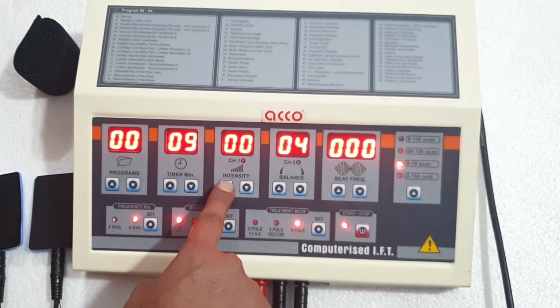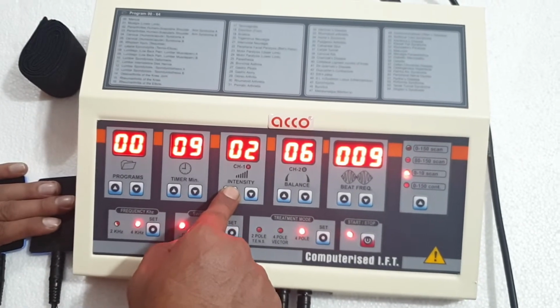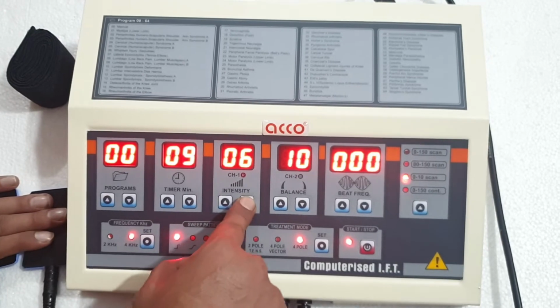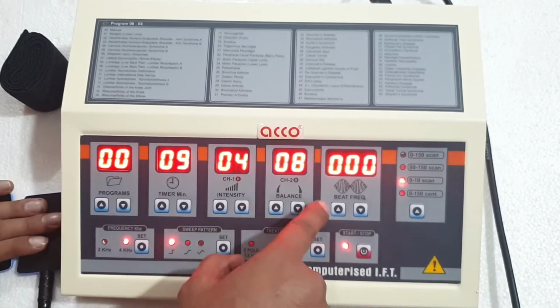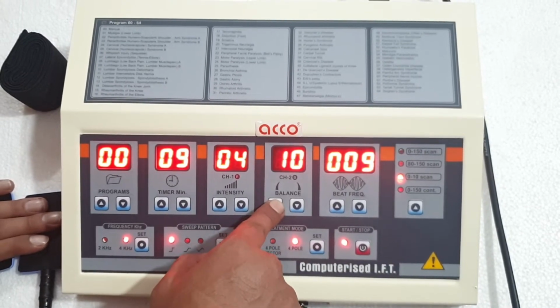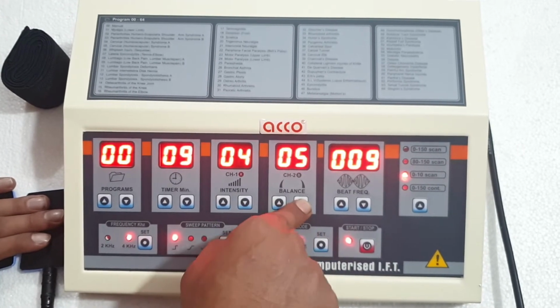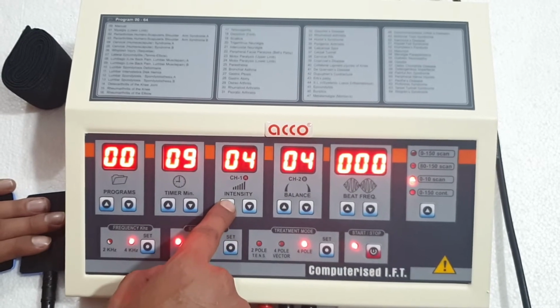Now you can increase the intensity. Channel 1 up, intensity down. If you want to make the balance at 0, you can make it equal. Now both the channels will produce the same current.